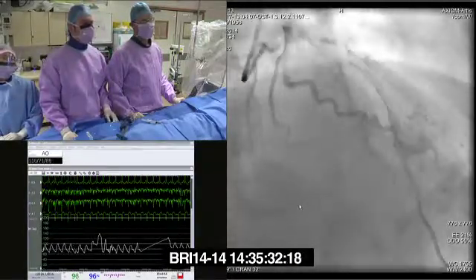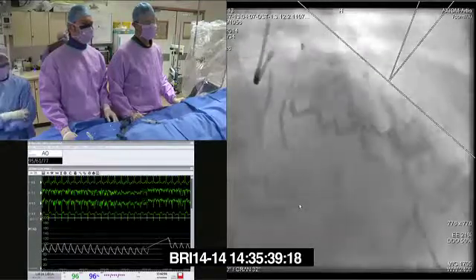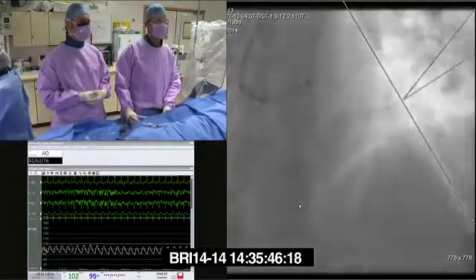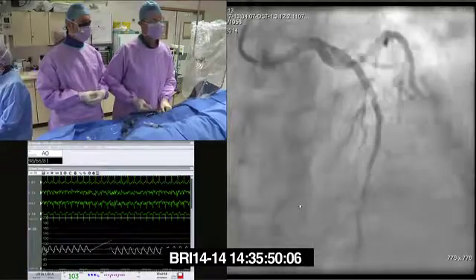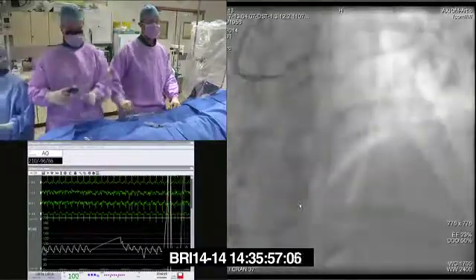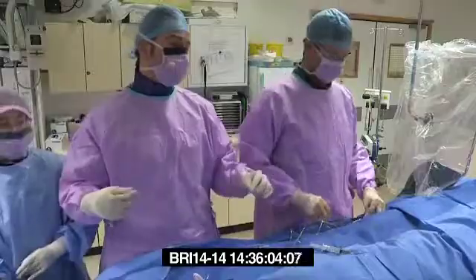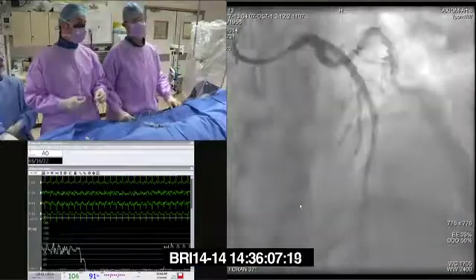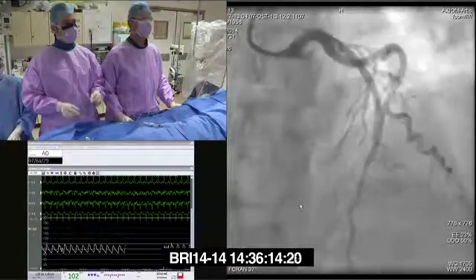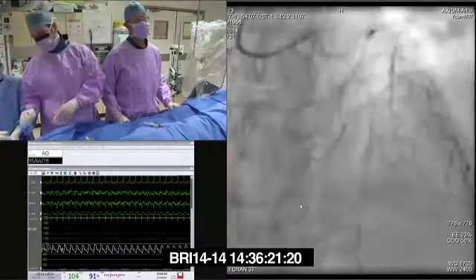TIMI 3. AP cranial. That's moderate. Distal edge disease. Can we get the IVUS machine? Let's just do it. Makes sense. Try and work out what is the pathology of that part there. I think it's a reasonable thing to do. Or another option would be the OCT, which might disclose. I think that's being used next door. What I want to see is into the wall of this artery, quite deep. I think both are very valid.